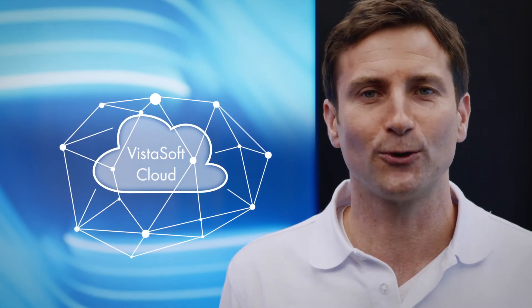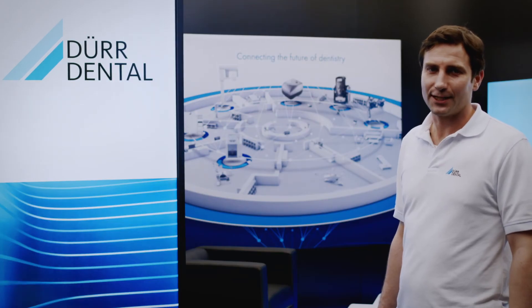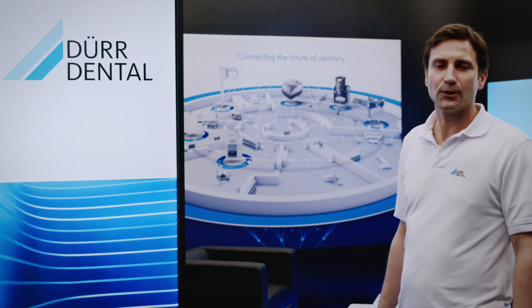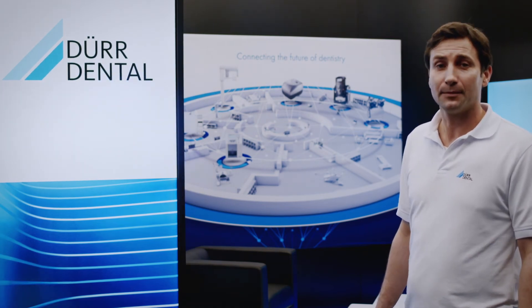Share image data with patients and colleagues easily, quickly and safely. The interfaces VistaEasy, ImageBridge and Twain also form part of the scope of delivery and enable the VistaScan NanoEasy to be operated using any other standard image processing program.